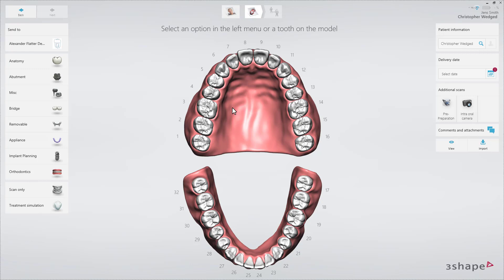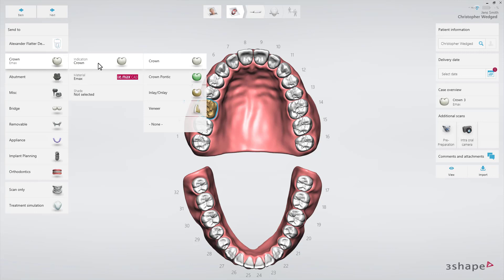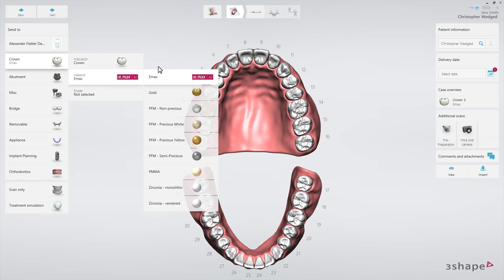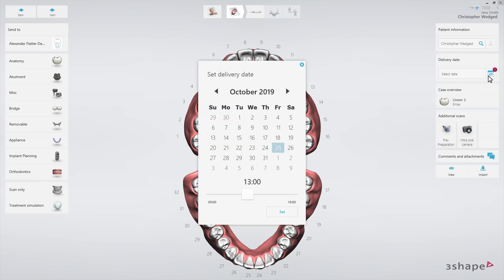Select the tooth that needs to be restored. The tooth will be highlighted in blue. In this case, we're planning to make a single crown. Click on the Anatomy drop-down list to select Crown, then select Material in the Material drop-down list. Finally, set the delivery date by clicking the Delivery Date button.